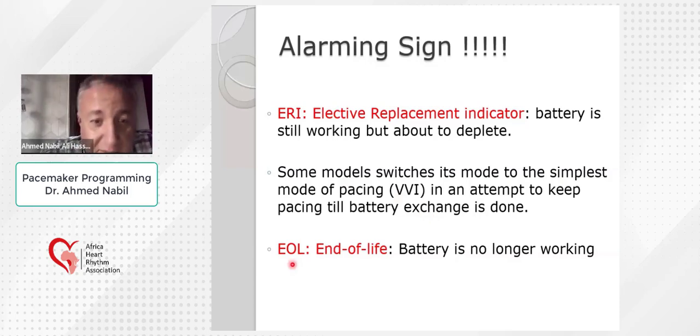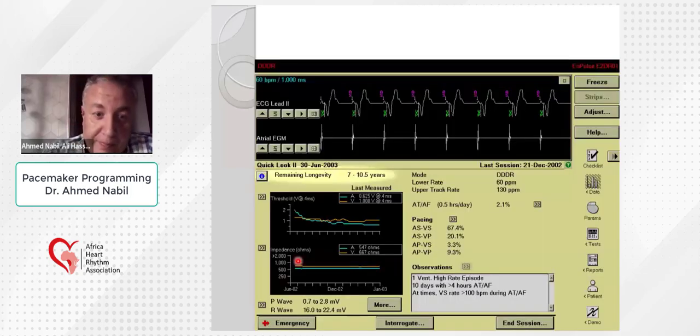On the other hand, the term EOL, end of life, means that the battery is no longer working and there is no pacing from the device, and it is completely non-functioning.